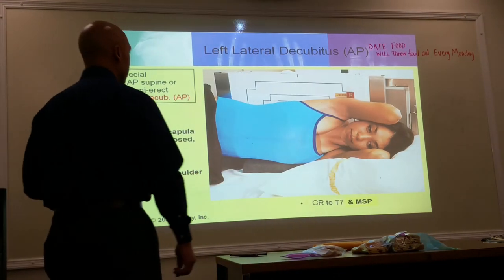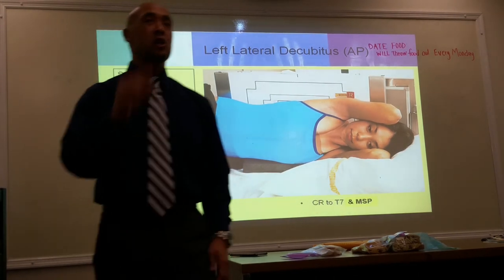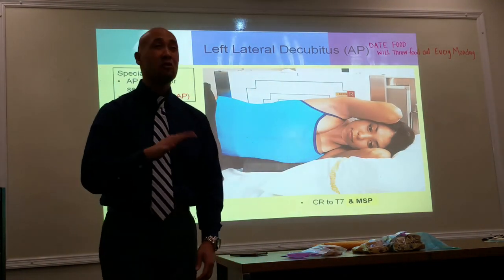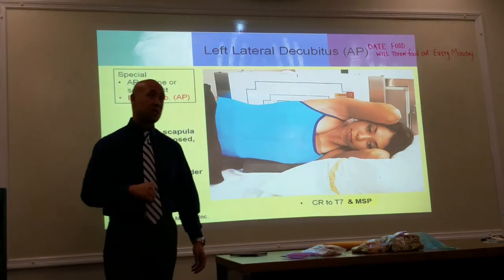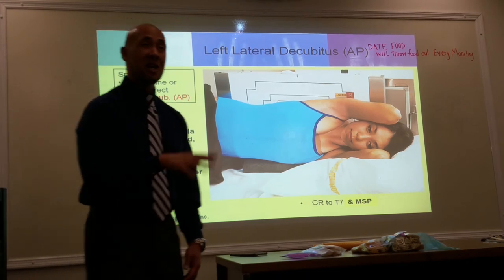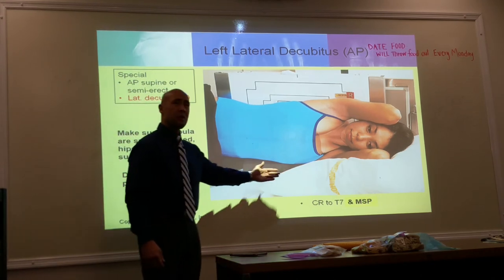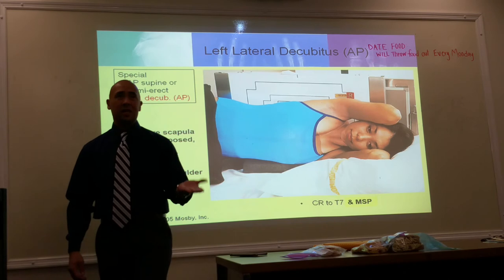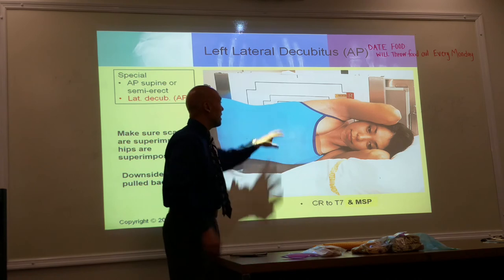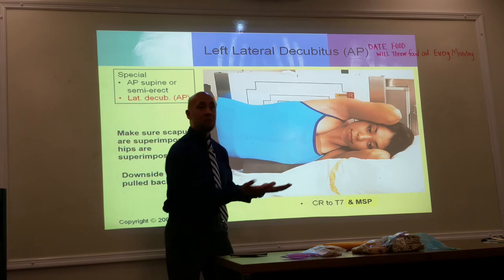Now, before you shoot the x-ray, I'll talk about position here in a moment, but when placing them on their side, you don't take the x-ray immediately. You want the fluid levels to settle, so you may have to wait about maybe 5 minutes or so before you make an exposure. Okay? So once you get them on their side, wait about 5 minutes or so. Now in doing so, when you get them on their side, you want to prop their chest up, because remember the divergent beam, if they're not raised high enough to place them in the middle of the image receptor, you're going to cut off the lateral border. So we want to raise them up a little bit.